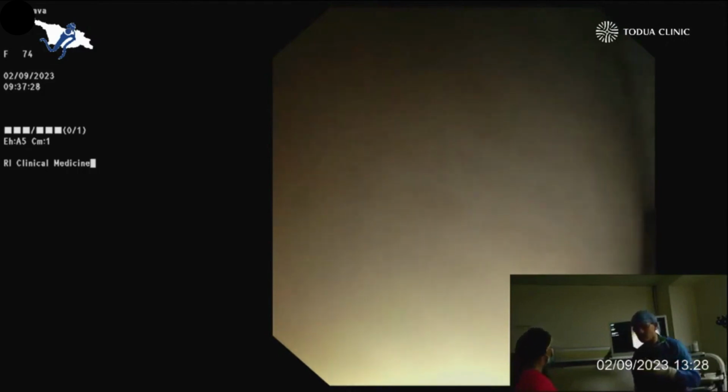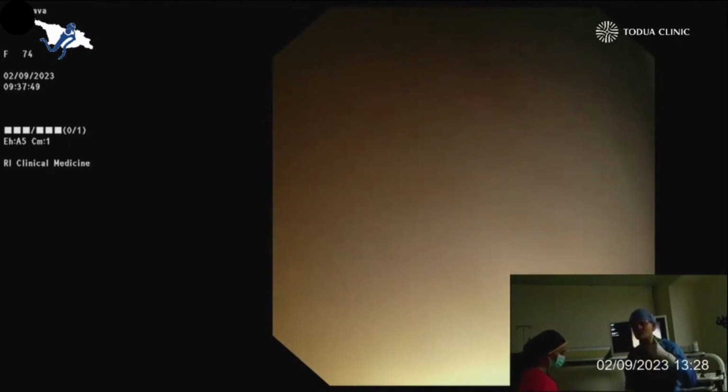So a computer tomography and an MRI were performed, and there the patient now has a cyst in the pancreatic head. And when we have this situation, we have to check the cyst first by MRI, because the MRI and the MRCP give a very good anatomical overview about the pancreatic duct and the relation of the cyst to the pancreatic duct. And in the second step, we will now perform endoscopic ultrasound, to see the structures of this cyst, if there are nodules, if there are calcifications, etc. And then we have to make a suggestion for the patient what to do.